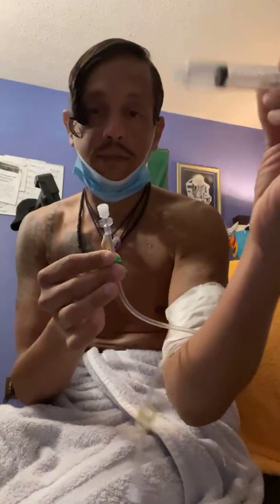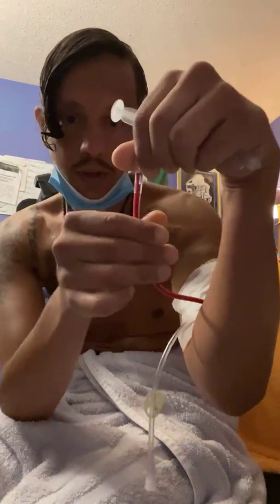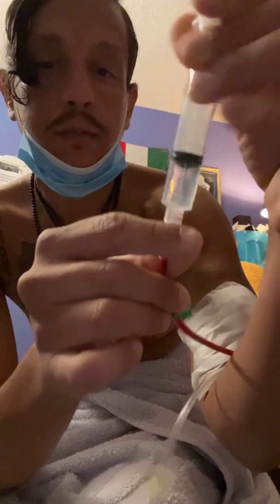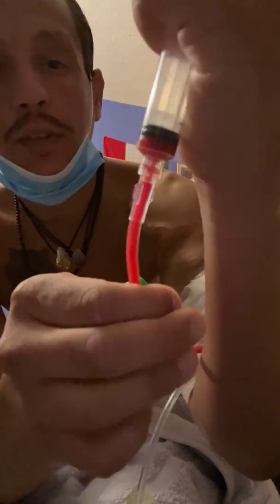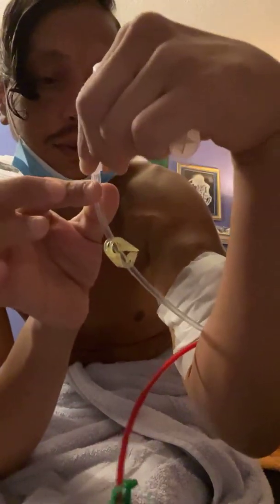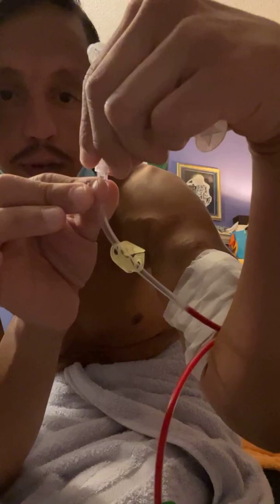So now we have to feed the blood into the tube. Saw that? Ooh, that was quick. And then make sure that it's okay. Everything's okay. Make sure that it feels good. To all my future dialysis patients, you can do it. You're okay. Just take care of yourself. Watch the blood. Watch the blood.